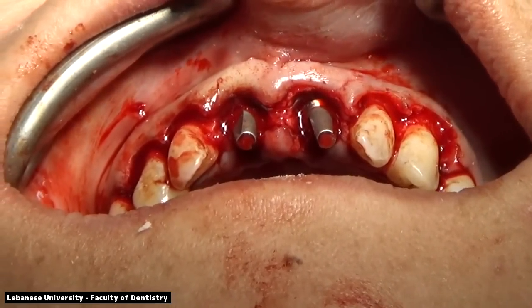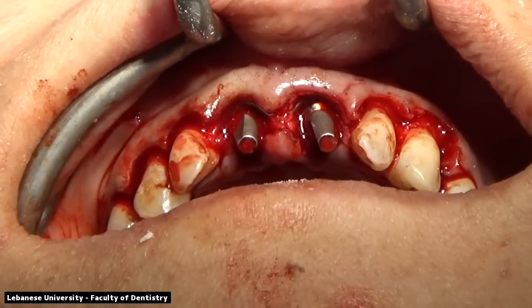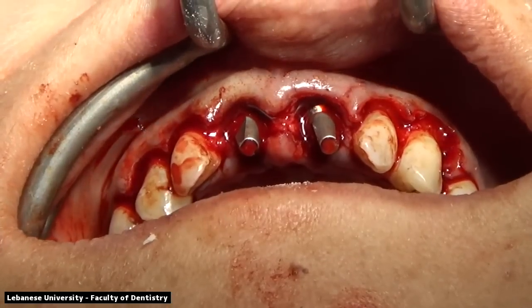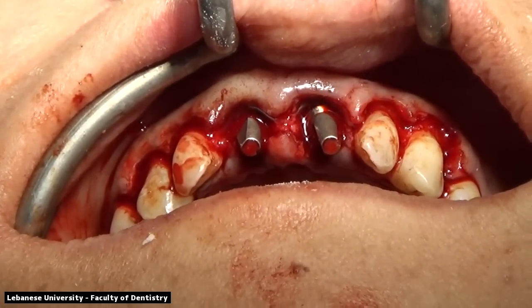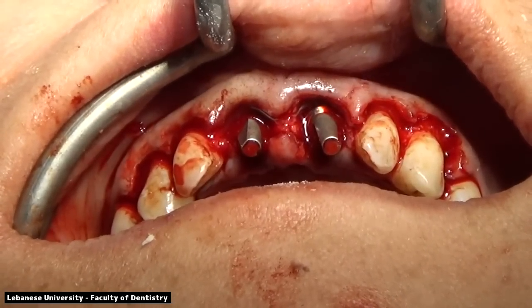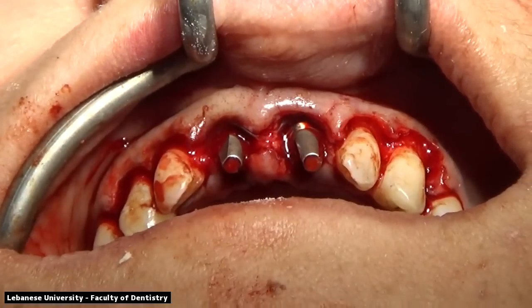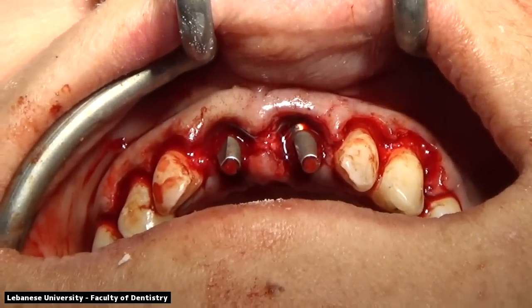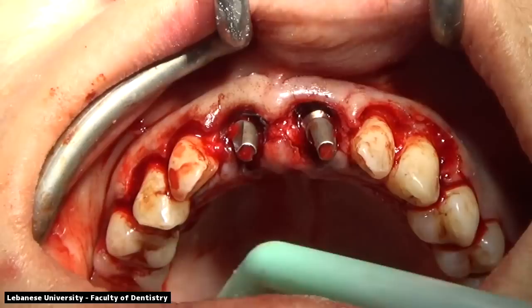The final step after the temporary restoration adjustment would be adding the bone particulate matter in between the gap of the implant and the buccal plate of bone, and then suturing the site. Since we have thick buccal plate of bone and thick soft tissue with intact periosteum, we will not be placing a membrane. In this case, it will only be a particulate bone graft to fill the gap and prevent the collapse of the buccal plate of bone.